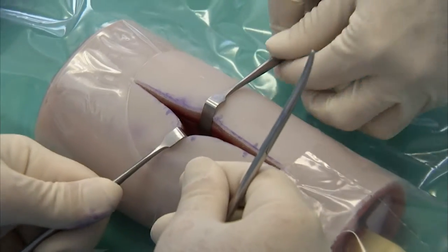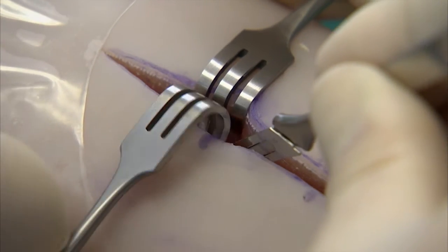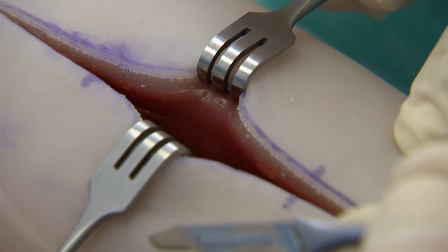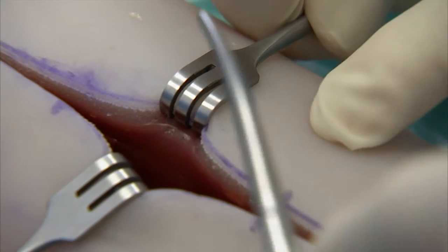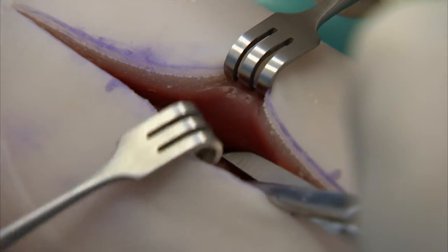Use the paw side of the cat's paw retractor initially. As one goes deeper down into the wound, the flat side of the retractors will be better for retraction and thus maximizing the surgeon's view of the surgical site. Respect the tissue and thus handle the tissue gently. Use a pair of dissection scissors to perform blunt dissection into the depth of the operative wound.